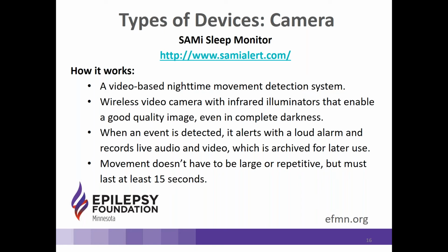Because the camera is always running, it live streams, so you can basically watch it at any time. You can use it sort of like a video baby monitor. The difference is that it has that program that will actually detect the abnormal activity and start recording when it happens and alert you when it happens in case you don't happen to be watching.